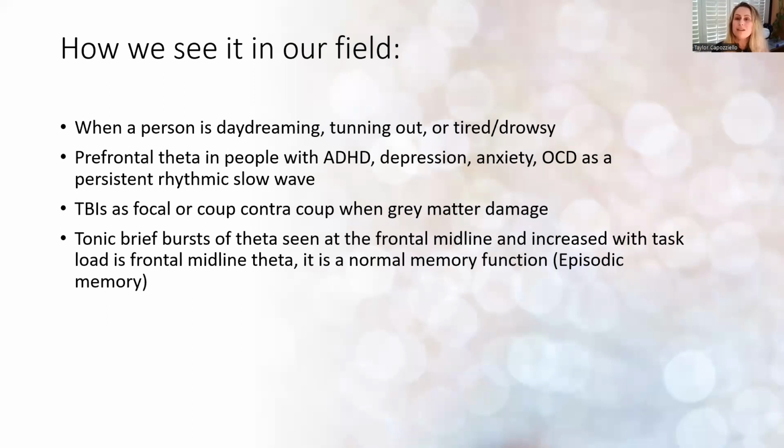For this, it's when there is gray matter damage. So white matter damage for delta, gray matter damage for theta. And we're going to see it in tonic brief bursts of theta at the frontal midline increased with task load, and it is a normal memory function.